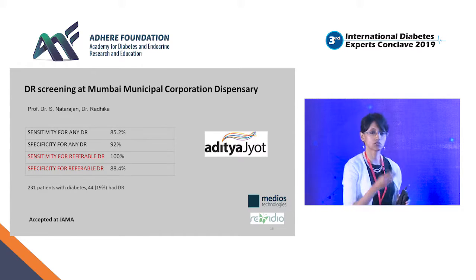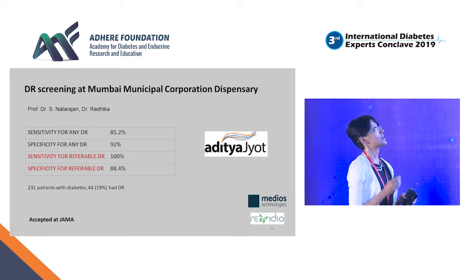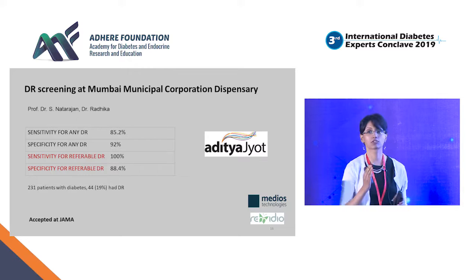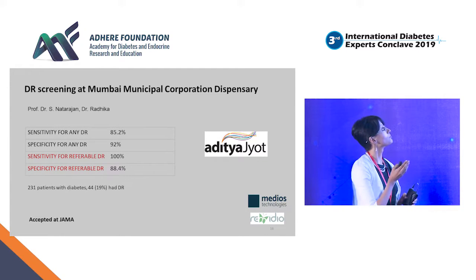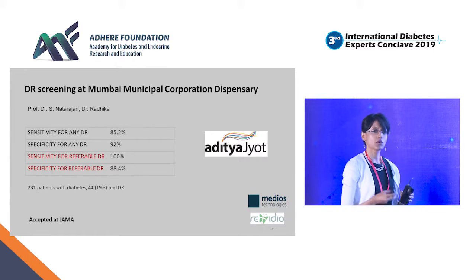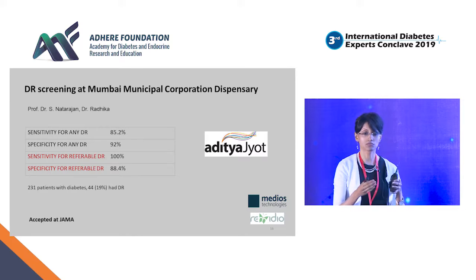This was at Aditya Jyot Hospital in Mumbai by Dr. Natarajan, a vitreoretinal surgeon. Some of you here might know him. We're all from Maharashtra. So they found that in individuals with diabetes, the sensitivity for referable diabetic retinopathy was 100%, and then the specificity was 88.4%.